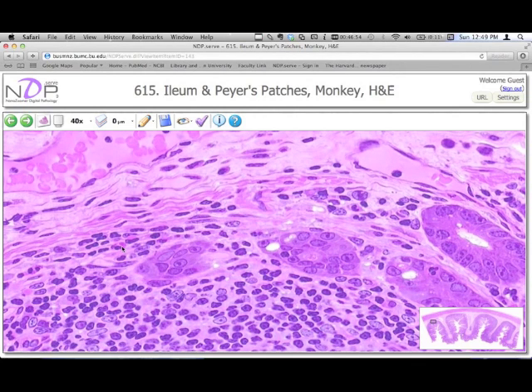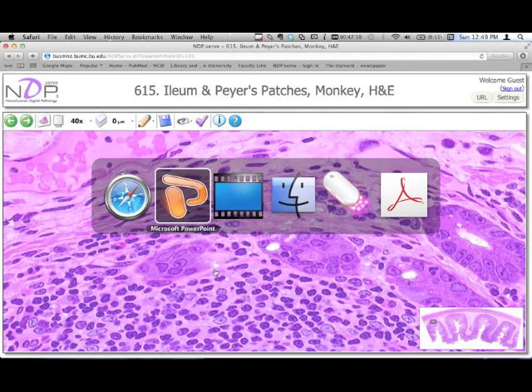Okay, something along these lines. So those are the two instances that we're going to think about. This is certainly eosinophilic granules. There is a round nucleus here, but both of these things present some problems. So this is really where things get tricky.